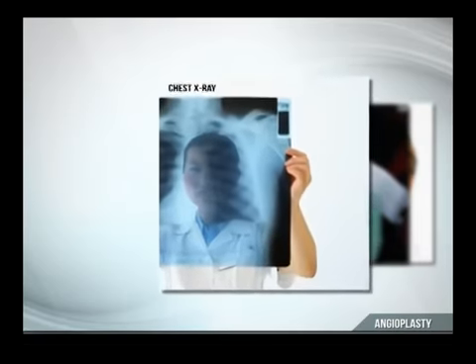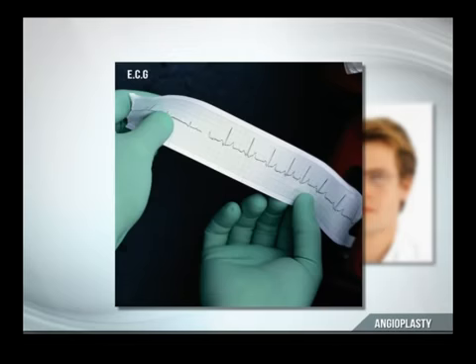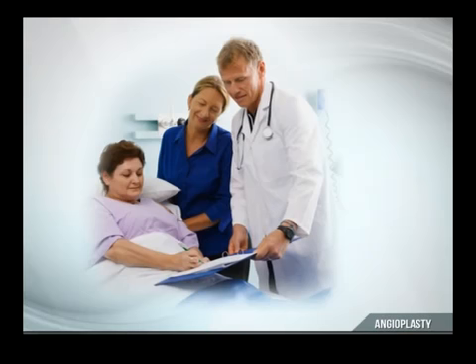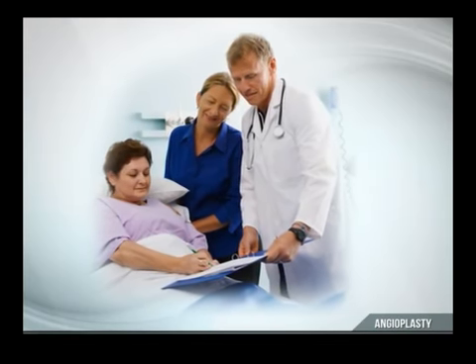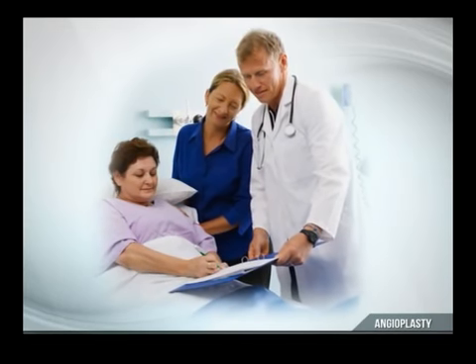Pre-procedure tests like chest X-ray, ECG, blood examination are scheduled before the procedure. You will be asked to sign several consent forms stating that you understand the procedure and are ready to comply with the medical team for the same.